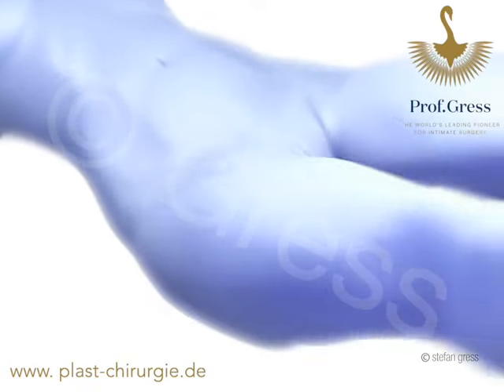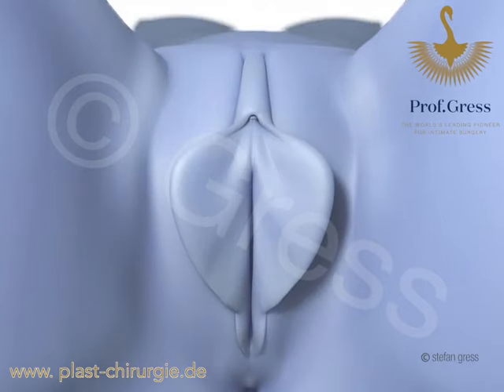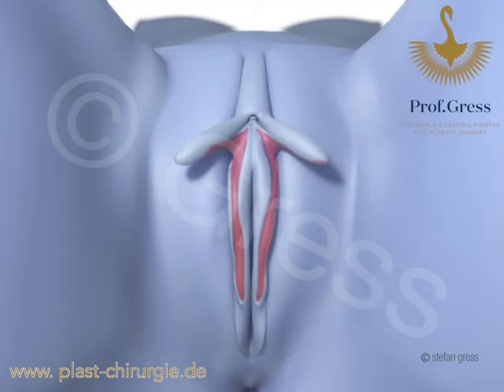This is the technique for reduction of the labia with correction of the clitoris position. The excess tissue, marked in orange, is removed with a laser along the entire length of the labia minora up to the top, as well as an additional area of skin below the clitoris.